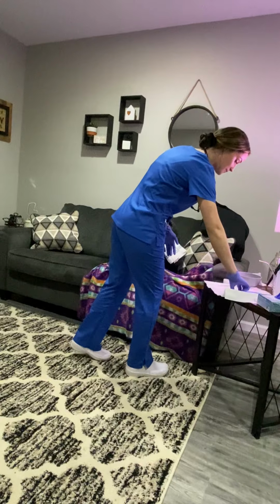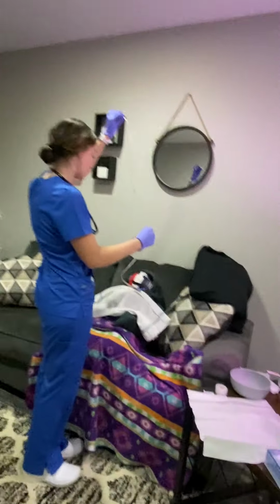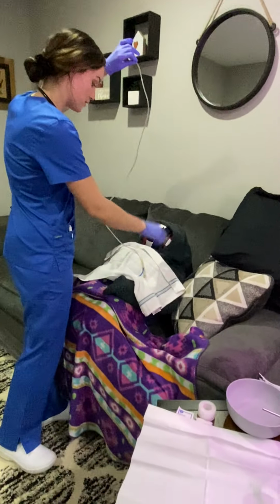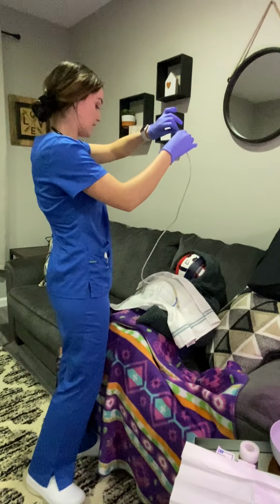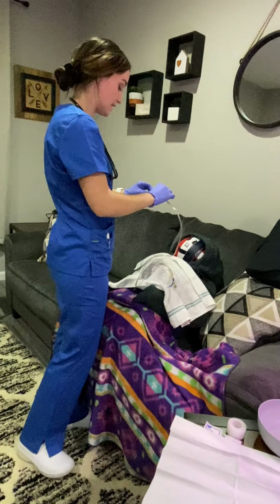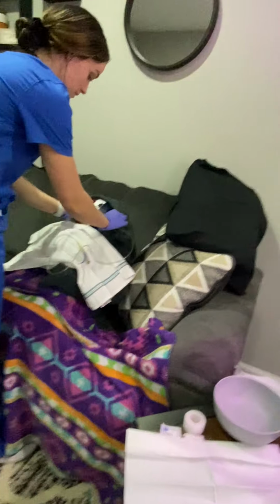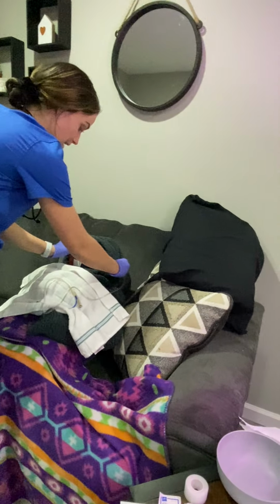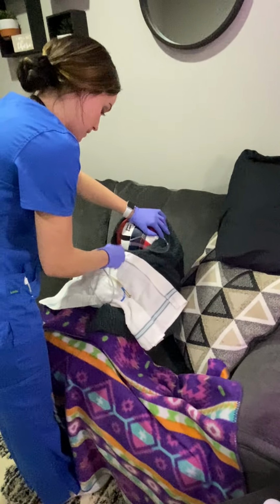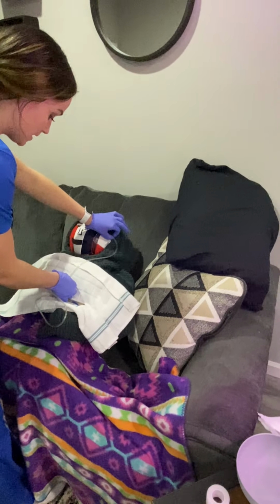So I'm going to do some measurements first of my tube. So after assessment, I have figured out that her left naris is patent and good for use after looking in it and not seeing any loss of tissue integrity or anything like that. So we're going to use the left naris. I'm going to measure from the tip of the nose to her ear, and I'm going to mark that. And then from the ear down to the xiphoid process. And I'll measure that right there, so I have my marking.